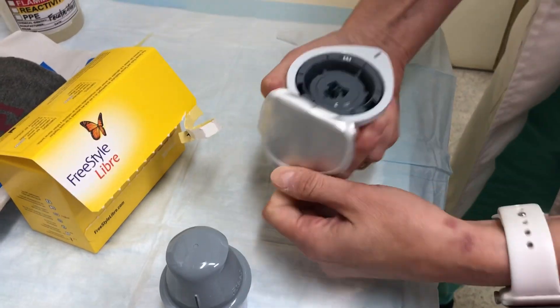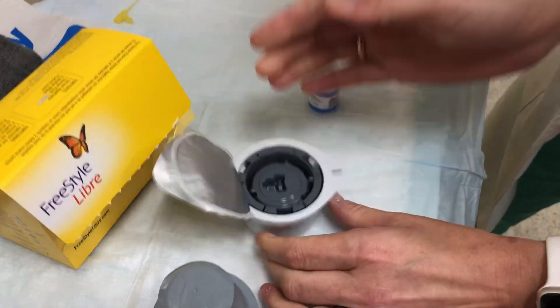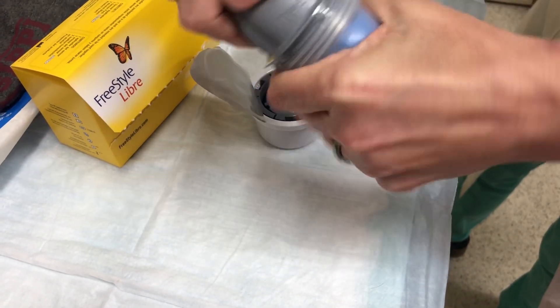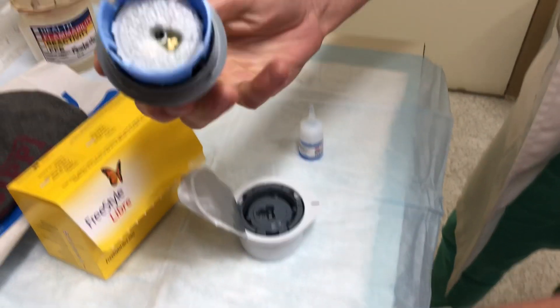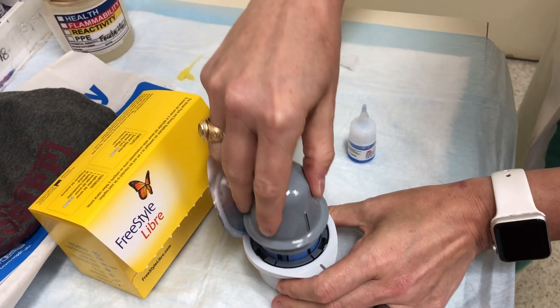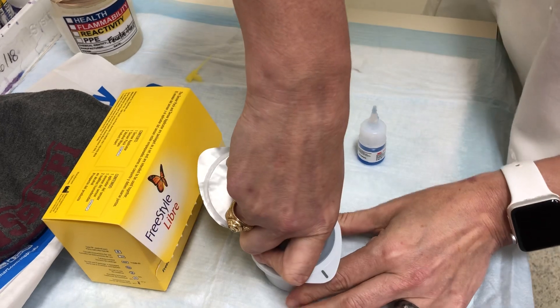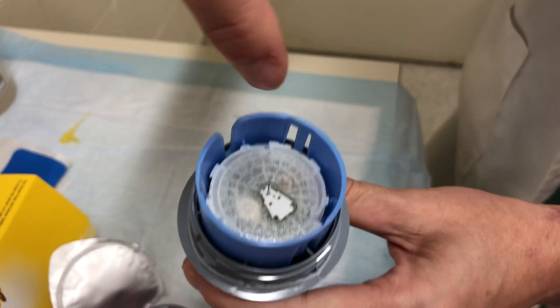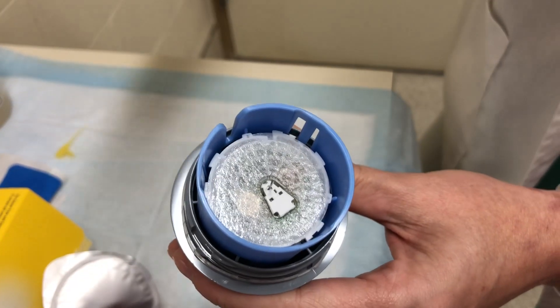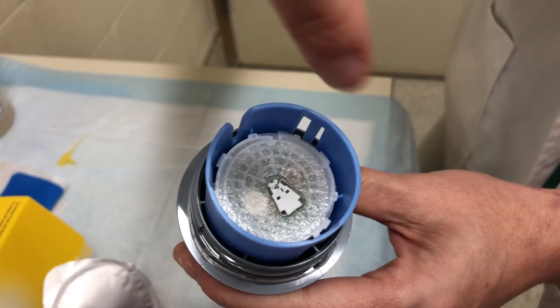This is the sensor, and this is the application device. You line up these gray lines, put it down there, push down, and pull up. There's a little sensor inside — actually the sensor is inside a little needle. This needle punches into the skin and then comes back out, allowing the flexible little sensor to stay in there.